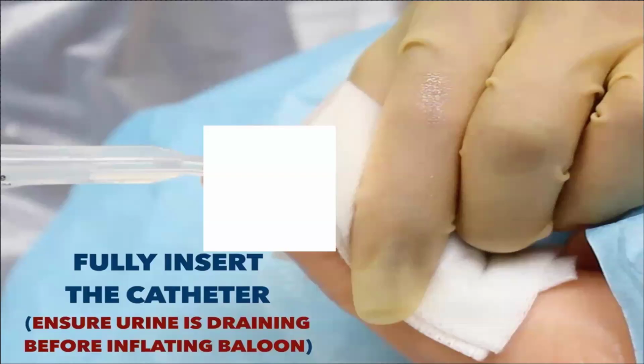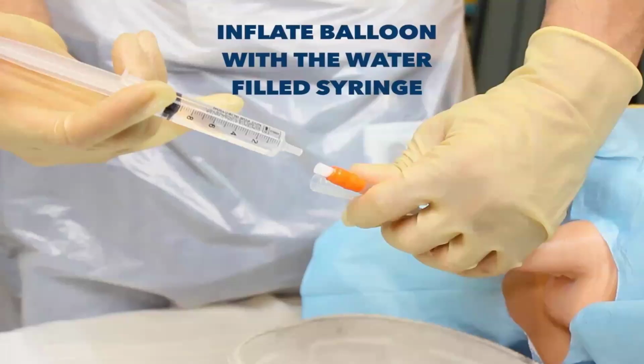Once you reach fully, you will inflate the balloon. Why should I insert fully? So I will be sure that the balloon is inside the bladder, away from the urethra, to not rupture the urethra.